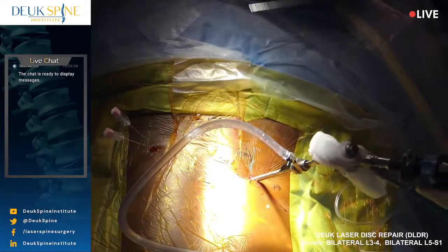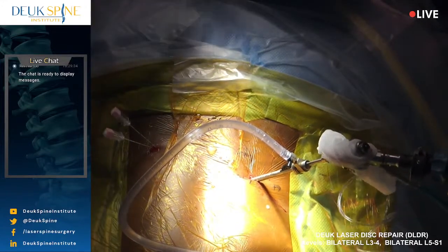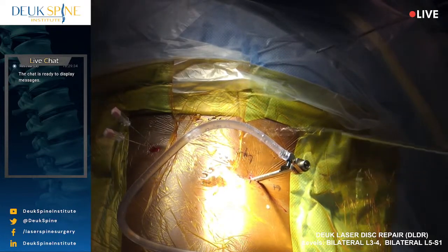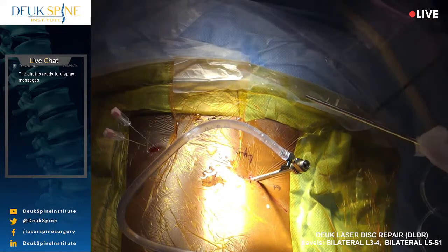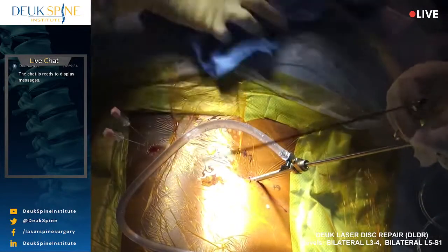Scope on, guys. I need my scope on. Hello? No, the scope. Listen, turn on the machine, yes, and then stand by. Thank you. I need that to show the scope up there. Oh my.